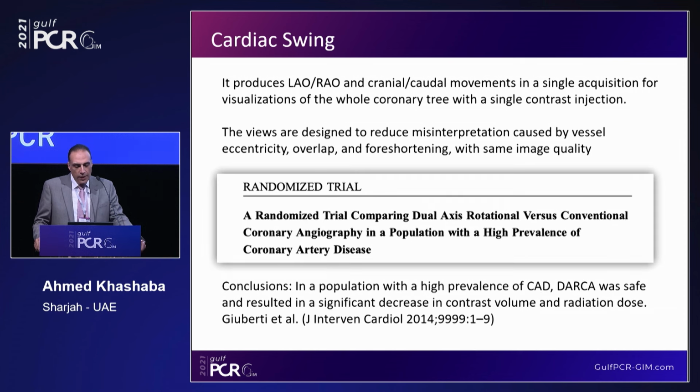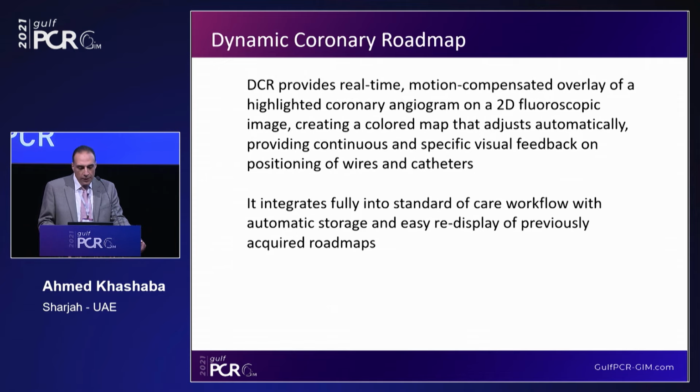This cardiac swing has been tested in a randomized trial, comparing it versus the conventional coronary angiography in population with high prevalence of coronary artery disease, and it was found to be safe and resulted in significant decrease in contrast volume and radiation dose in that study.